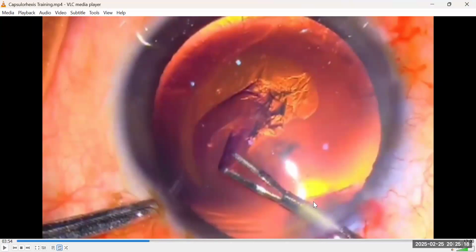All right, I want to explain difficult areas in capsulorrhexis. Now, this incision definitely has a nasal margin and a temporal margin. I have introduced my instrument and unfortunately or fortunately, my fulcrum is wrongly positioned. This is the lateral margin of the incision, and I am working on the lateral half of the eyeball.